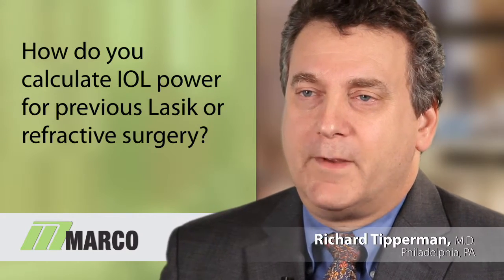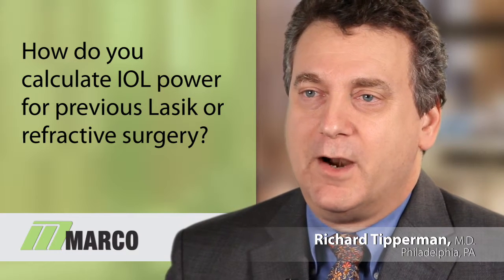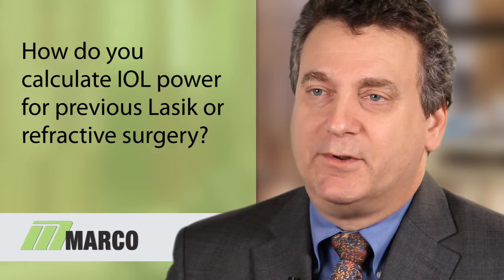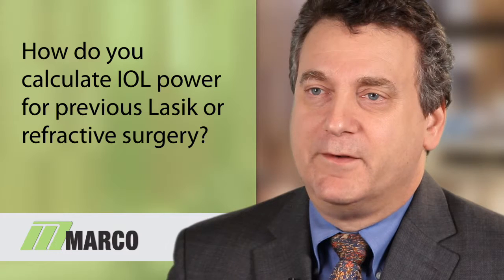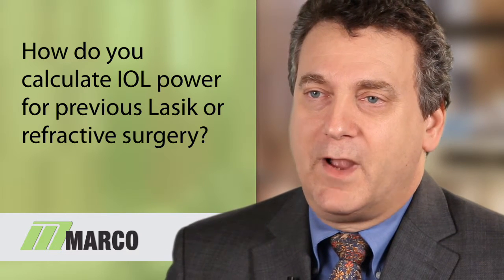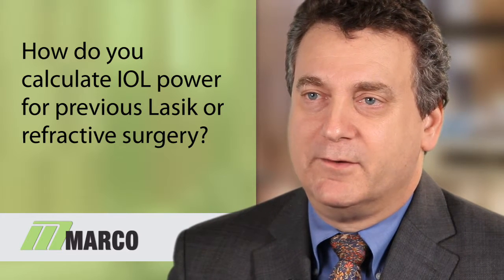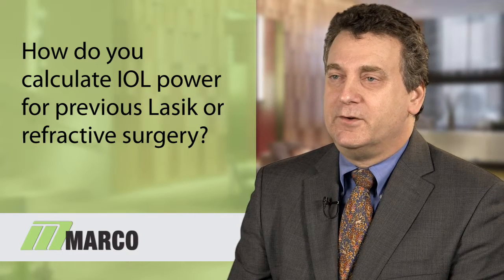Almost all cataract surgeons talk about an upcoming tsunami of patients coming in for cataract surgery who've had prior refractive surgery. And being able to calculate the appropriate strength implant for these people is really critical, because any patient who is willing to undergo refractive surgery to achieve emmetropia certainly wants to have emmetropia following cataract surgery. And the better information you can have to do your calculations, the better job you can do for your patients. We found the OPD-3 scan really indispensable in managing these patients for two reasons.